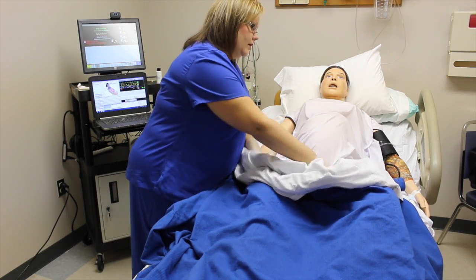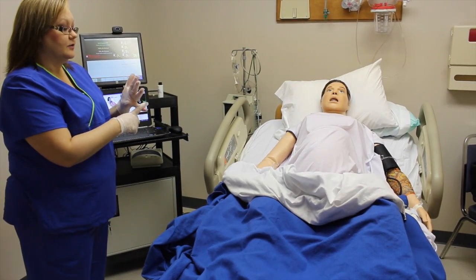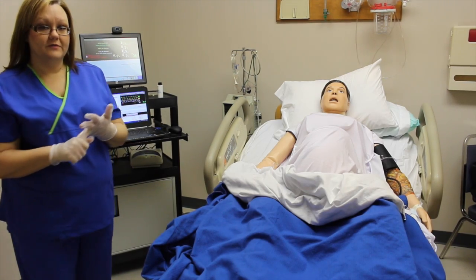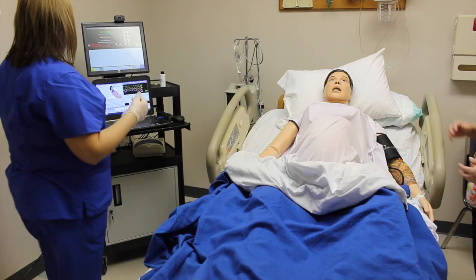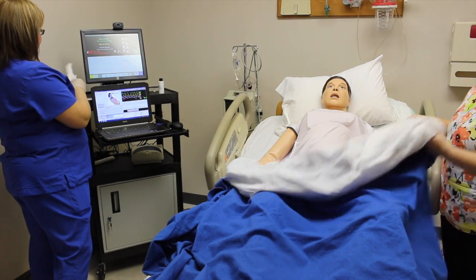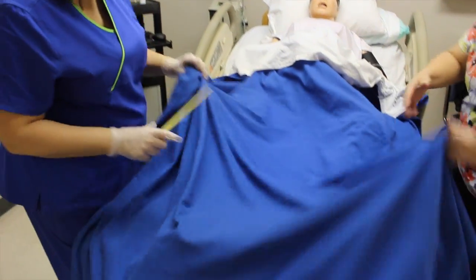One of the things that happens as normal labor progresses is that either the membranes rupture spontaneously or the physician ruptures the membranes. So that's what we're going to show you now, the rupture of membranes. We're going to actually use an amni hook, like they would use in the obstetric setting.